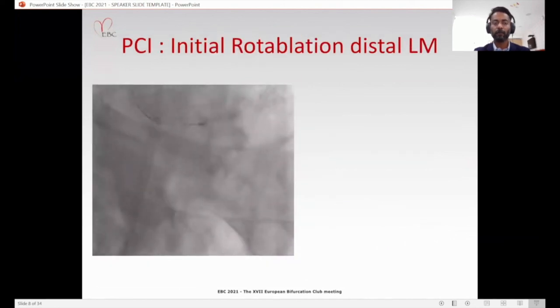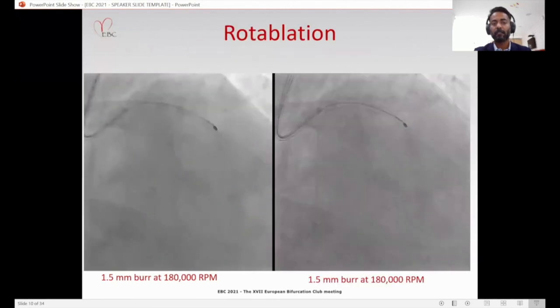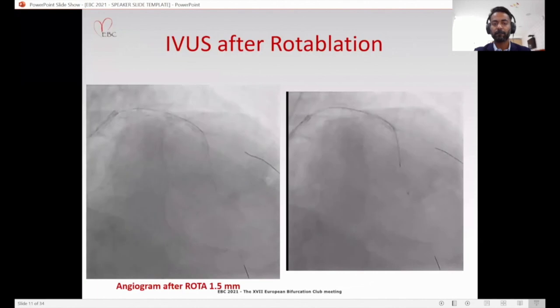So we used a 1.5 millimeter burr for the distal left main, which crossed successfully. And then we used the same 1.5 millimeter burr for the mid-LAD, which crossed after some time as there was some tortuosity in the mid-LAD. So after successful rotablation, we protected the diagonal and we did the first IVUS scan.